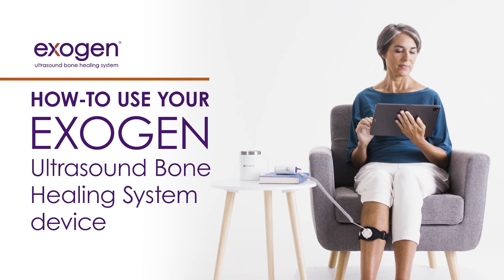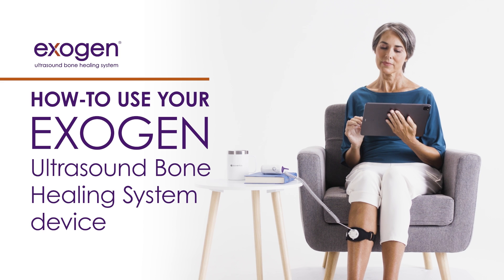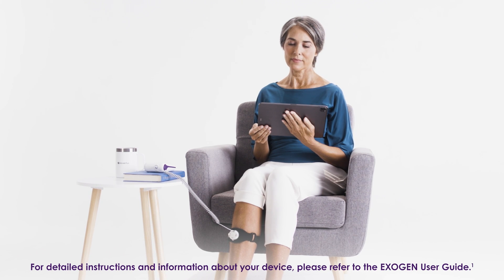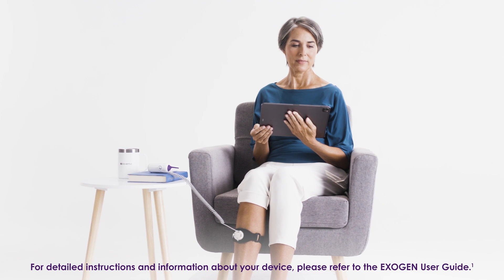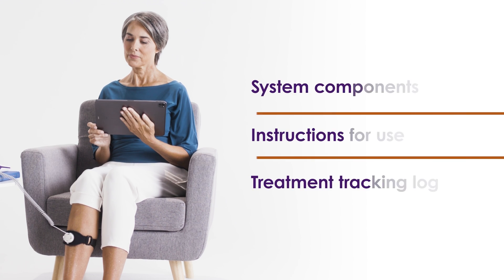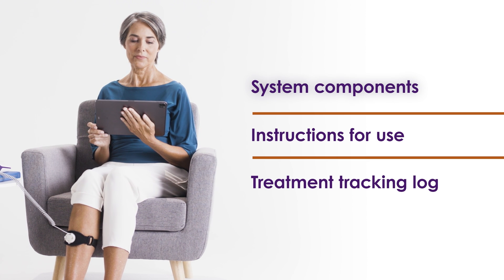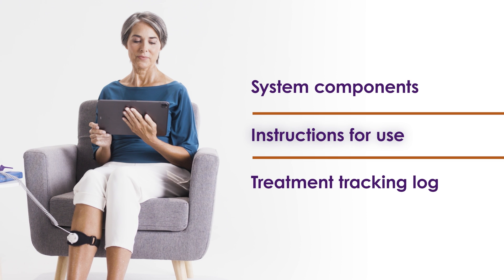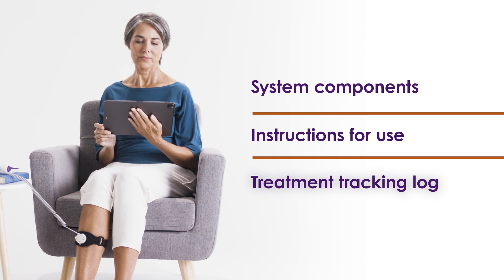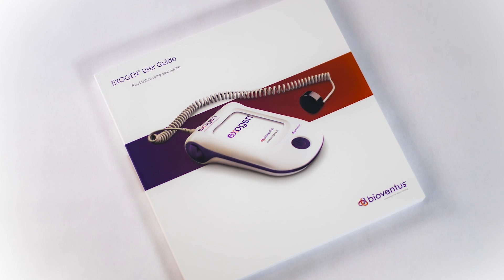The Exogen Ultrasound Bone Healing System is a lightweight, portable device that helps promote the healing of broken bones. Treatment takes just 20 minutes a day, making it easy to fit into your daily routine. This video can help you get the most benefit from your Exogen device. It covers the components of the Exogen system, step-by-step instructions for using Exogen, and an overview of the device's treatment tracking log. This information is also available in the Exogen User Guide.